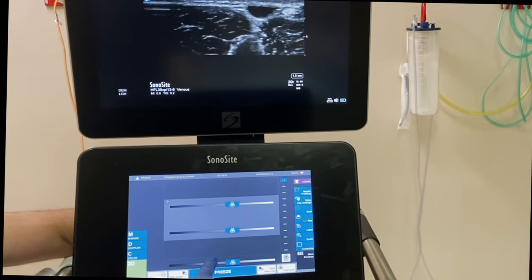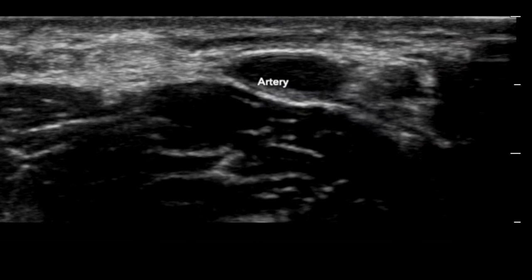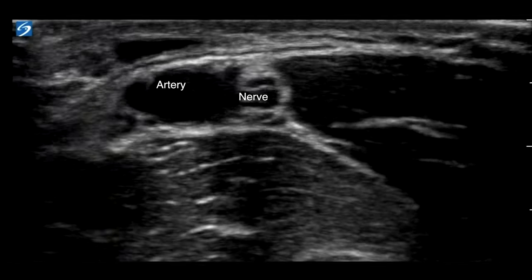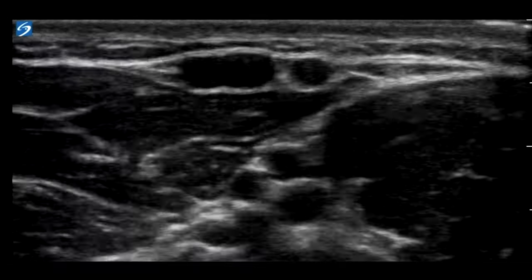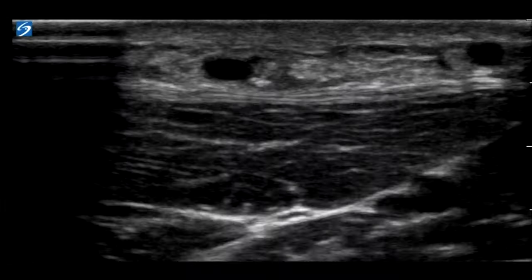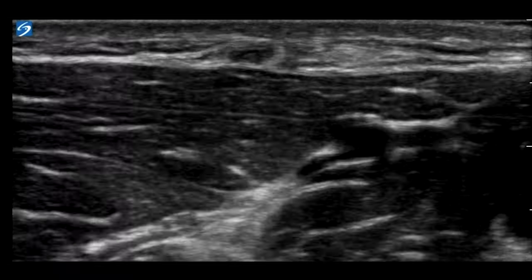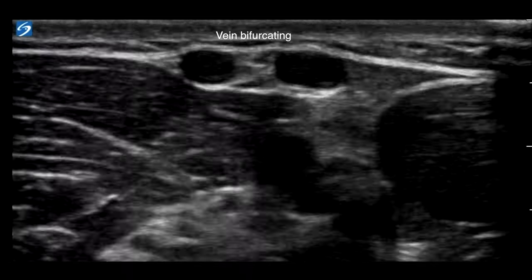The aim of a scout scan is to identify a suitable length of vein, whilst avoiding other important structures such as arteries, tendons, nerves, etc. Veins are easily compressible and non-pulsatile structures, whereas arteries are pulsatile and quite hard to compress. Select a long section of vein to match the chosen cannula.